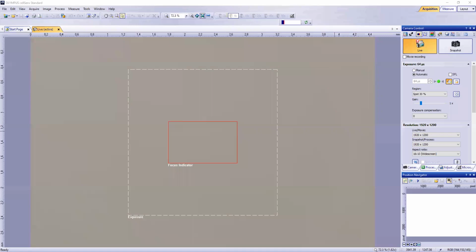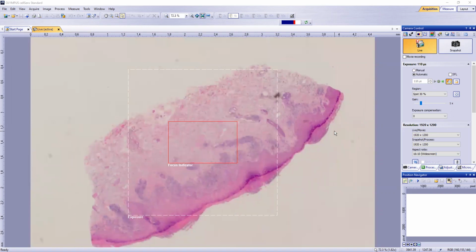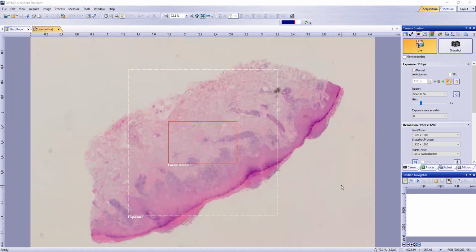So I'm going to share my screen. And first, to give you an introduction to the two basic ends of the spectrum of the interface reaction pattern, I'll highlight two disease entities. The first one is Lichen planus, which is essentially the prototype for your lichenoid interface reaction pattern.